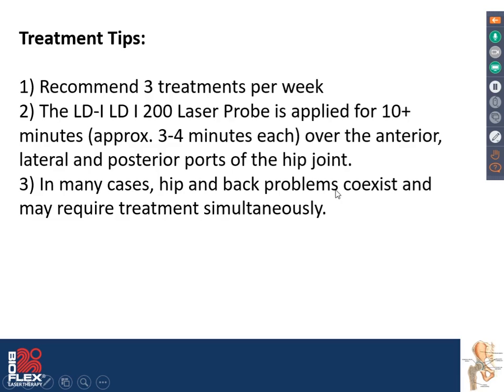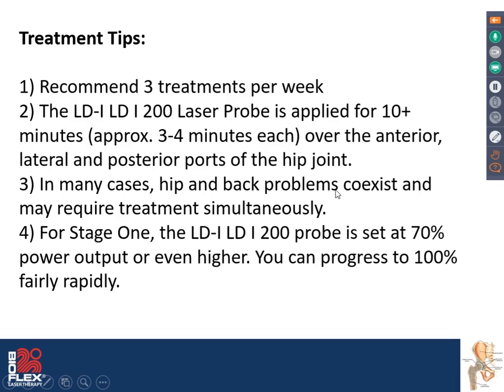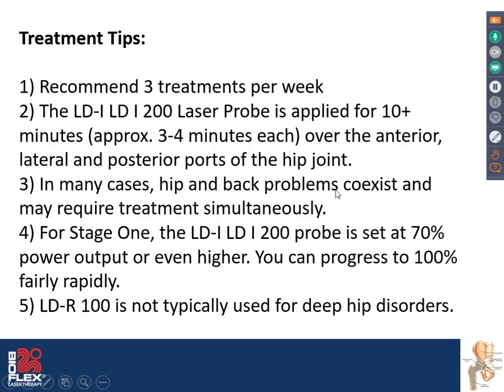In many cases, there might be back problems as well that's creating problems, so make sure you examine the back and treat that if necessary. For stage 1, the LDI 200 is set at 70%, but you can start even higher and you can progress to 100% fairly rapidly. So within 2 or 3 sessions, you should easily be able to go to 100% power.